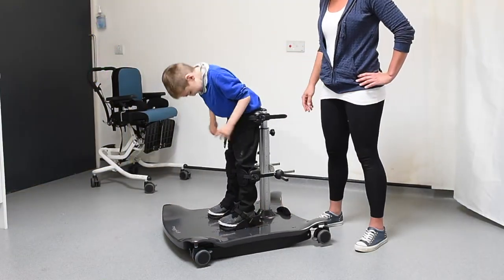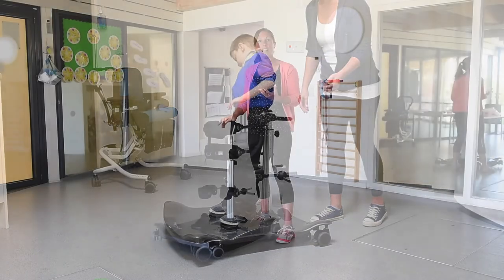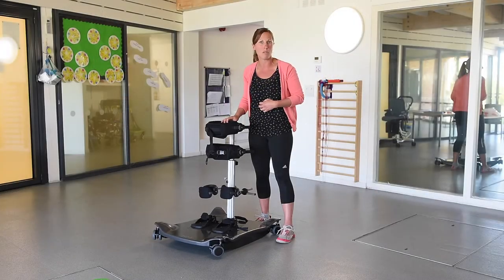We can then progress that further by reaching down and reaching up, all the time coming back into midline to challenge that core stability, posture and balance.